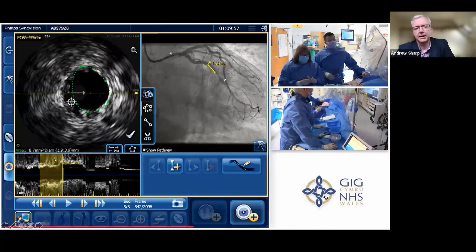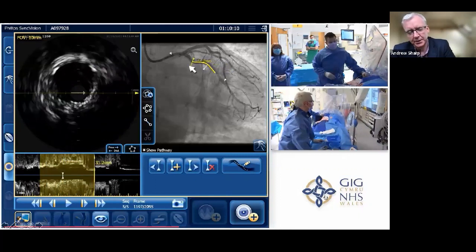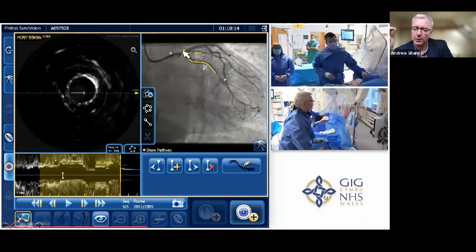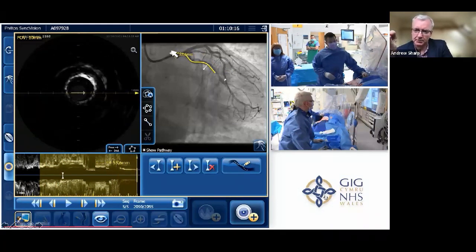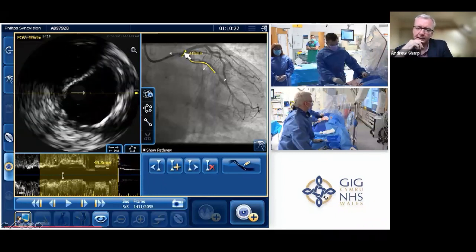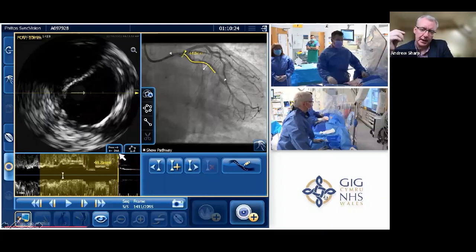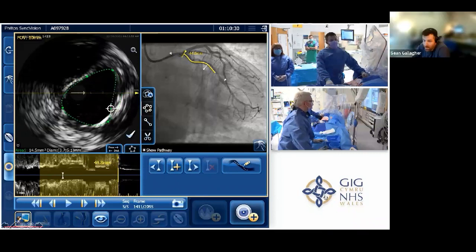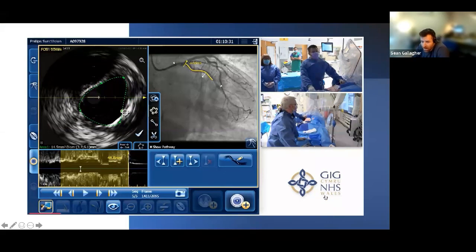No, and I think in EXCEL there was an appreciable amount of longitudinal stent injury. I think it was over 5%, whereby the operators had damaged the ostium of the stent without realizing, and it was captured on IVUS at the end. And so I personally try and land it, if it's a healthy true ostium, about 1 millimeter in. How about you? Do you always go near the ostium or at the true ostium? I think if you've got a healthy left main, a healthy shaft of the left main, I do exactly the same thing. I go near the ostium, but I don't hang it out.